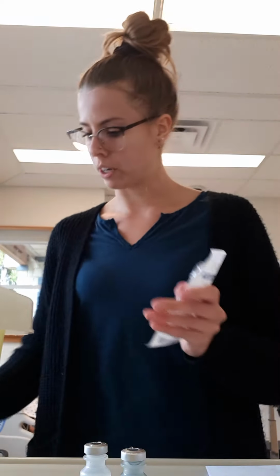And I'm going to prep all my equipment. So I have my 10 mL syringe. I have my 2 posi flushes, blunt filter needle, and my medication label.